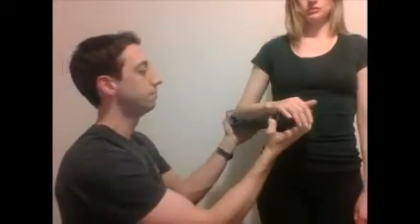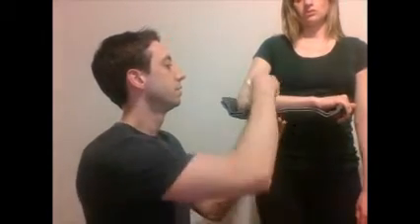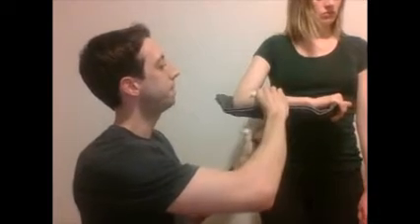And remember, with our fractures, we want to be supporting the joint both above and below on either side of that injured site, right? So we're going to support both of those joints. So that looks like it's in about the correct position we need. So we'll take that away and we'll instead put it onto the injured side. Okay, so you can see I've got both the elbow and the wrist supported. And we're going to hold that in place with some cling. Okay, we'll wrap it.